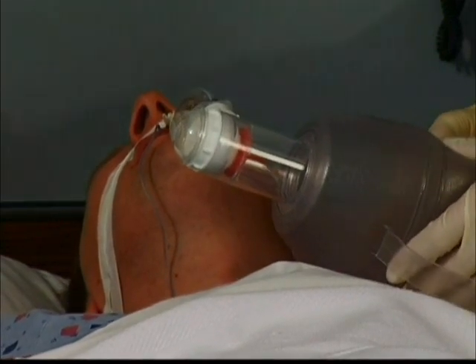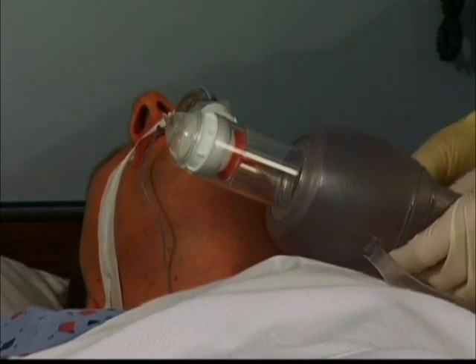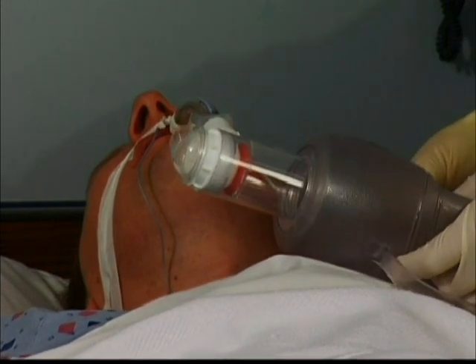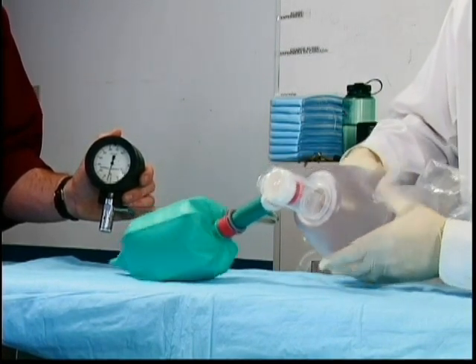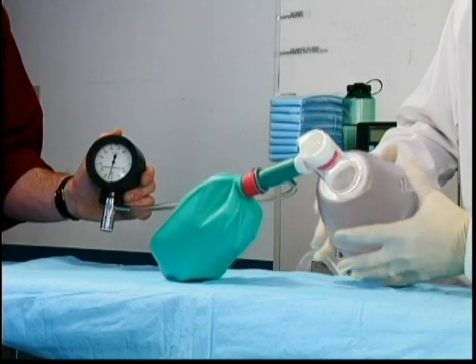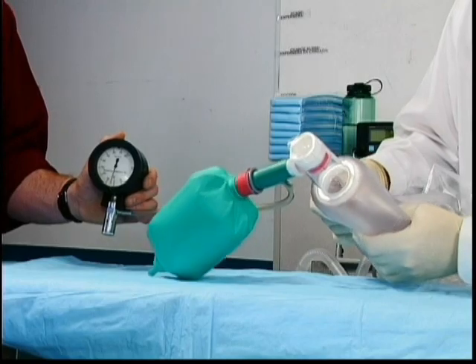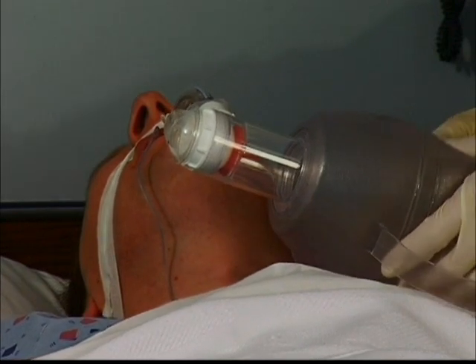The frequency is determined simply by how often you squeeze the bag. Unless otherwise specified by the physician, you will usually squeeze the bag 12 to 16 times each minute, or once every 4 to 5 seconds. While you must provide adequate ventilation at all times, studies have shown that there is a tendency to overventilate while bagging, so you must be careful not to hyperventilate the patient. Note that the harder and faster you squeeze the bag, the greater the pressure you generate. High pressure can be very dangerous and even cause severe injury to the patient's lungs. Practice squeezing the bag so that pressures remain less than 35 centimeters of water. It is also very important to synchronize squeezing of the bag with the patient's own inhalation, and it is imperative to avoid squeezing the bag while the patient is exhaling or coughing, as doing so will generate very high pressure in the patient's lungs.